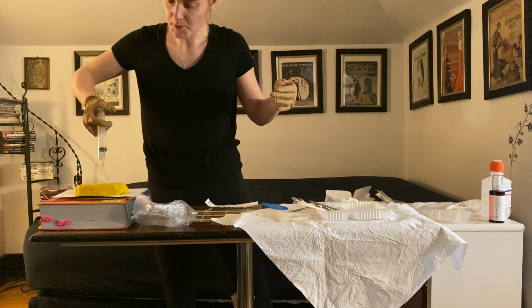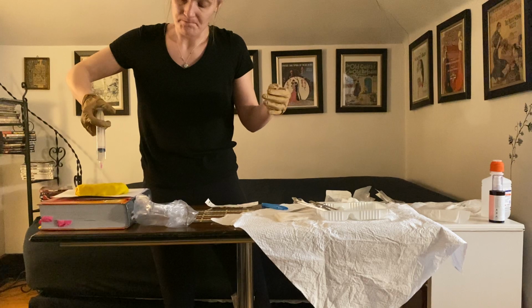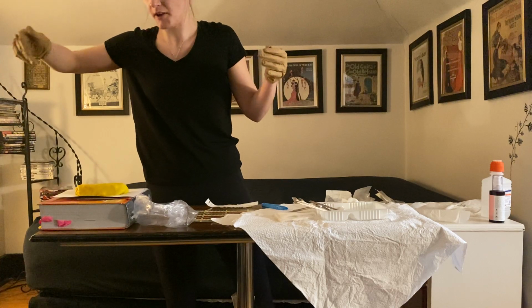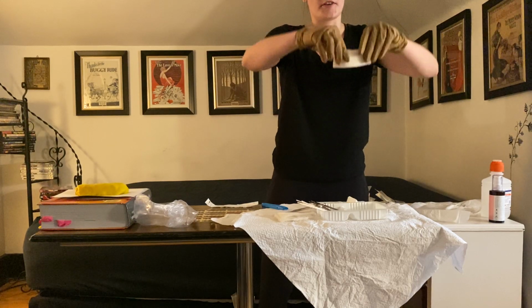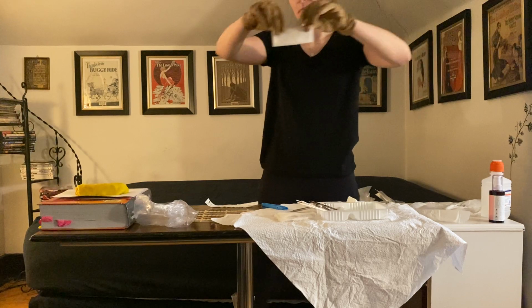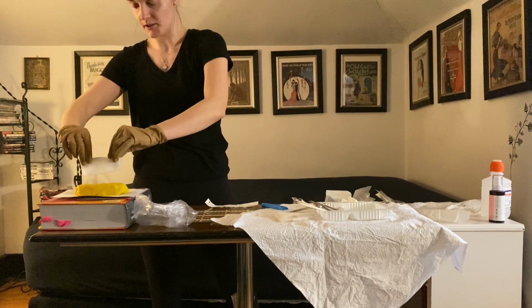Okay, and then for the purpose of this video, I'm not going to use the full 10 cc's because that would just be a mess. So I'm going to pretend I irrigated until it ran clear. I'm going to dispose of that, and I need to dry. So when I dip this in to sop up the normal saline, I'm going to just hold it steady, and I don't want to let it touch my gloves or the saline touch the gloves because I don't want to contaminate my sterile gloves.